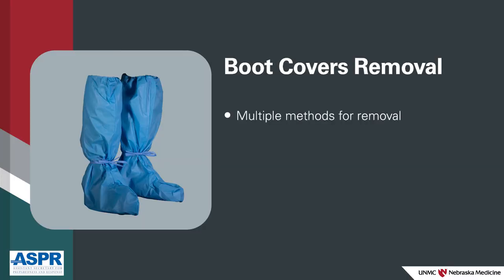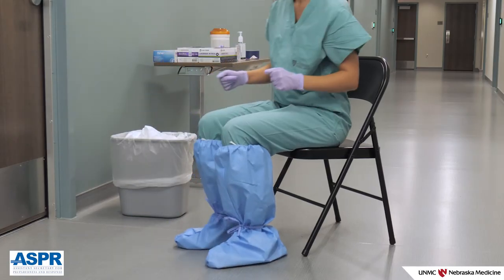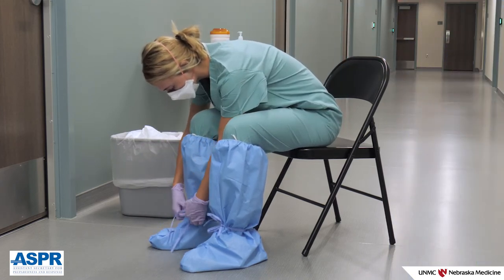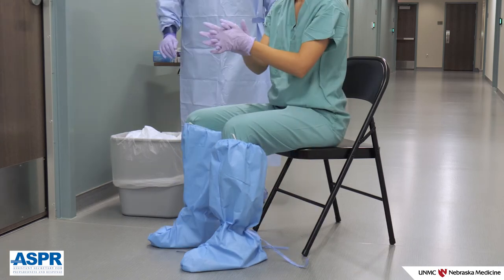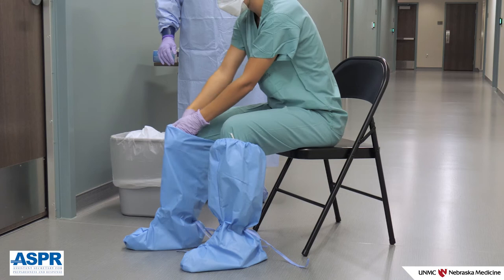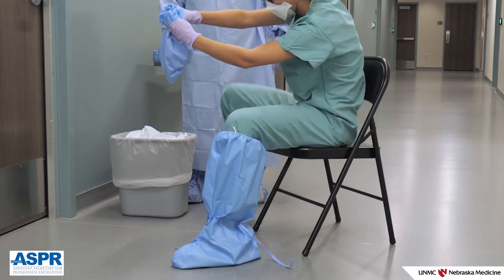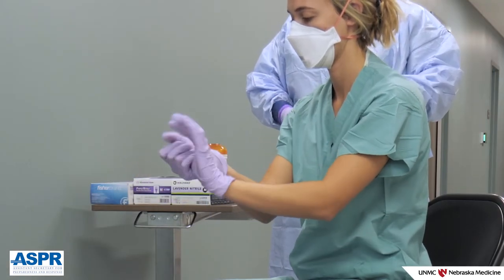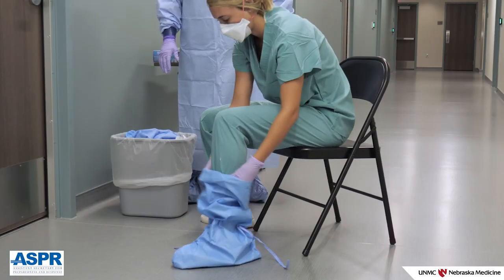There are multiple methods for removal of your boot covers. If you are tired, ask your doffing partner to assist you in removal rather than risking self-contamination. Self-removal can be accomplished in a seated position by either untying the bows securing the covers at each ankle, then performing glove hygiene. Slide your hands inside the cover and manoeuvre the cover down the leg and off the foot. Place the cover directly in the trash and move your foot into a clean area of the doffing space. Perform glove hygiene to prevent cross-contamination. Remove the second boot cover using the same technique and place in the trash.